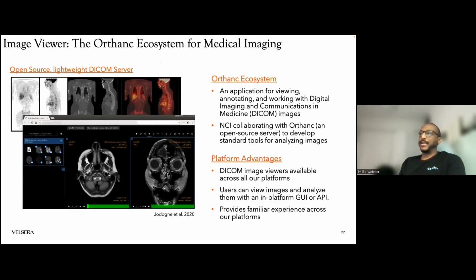And there are new data sets being added to it. It actually has a very large testing data set already. You can analyze images with a GUI or with an API, as I previously mentioned. And the NCI is also closely collaborating with that open source server of the DICOM images to keep the standard tools for analyzing the images up to date.